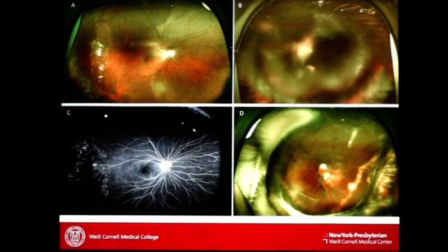You can see here, you know, my postoperative patient, I get the fundus image and good documentation that the retina is looking pretty good, okay? And in the right eye, now that I have the fluorescein function in the office, I don't have to take him back for an EUA or fluorescein. I get the follow-up fluorescein in the office, and I can see here that I have good laser, okay? And there's no more leakage. Everything looks much better, okay? So we're in good shape.